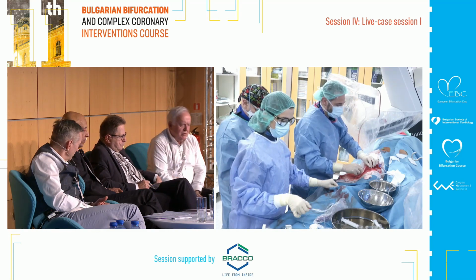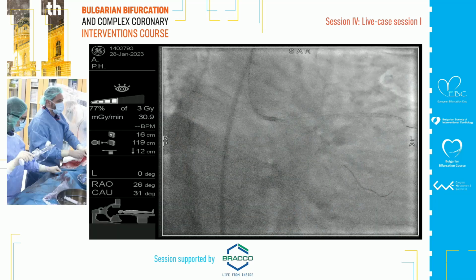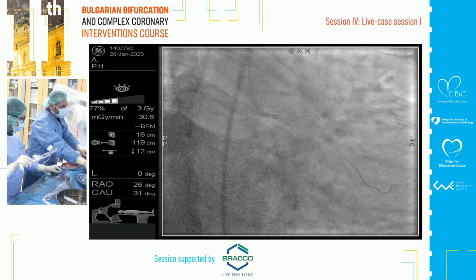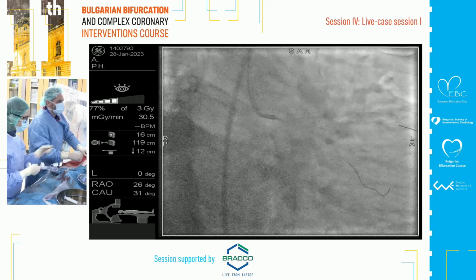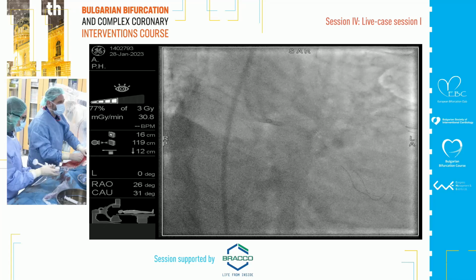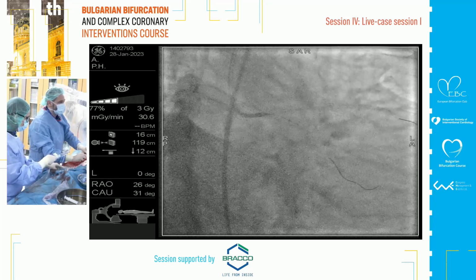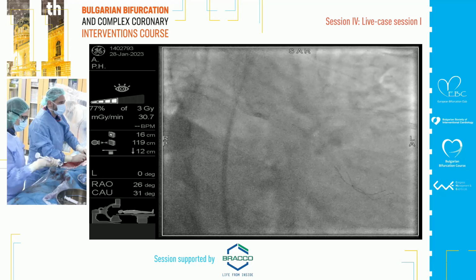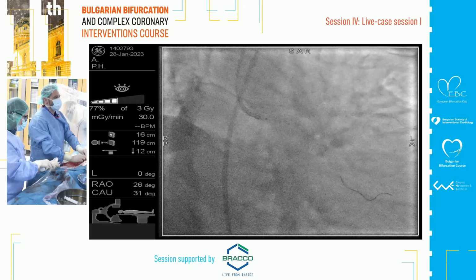Another reason for not crossing, which is today not frequent at all, is the crisscross of the wires. If you take two or more rotations of the wires to penetrate, that's the reason why I was recommending to remove all the wires. Now we are good. They cannot turn ten turns. No, it's going. It's good now. I think this is important to remember.